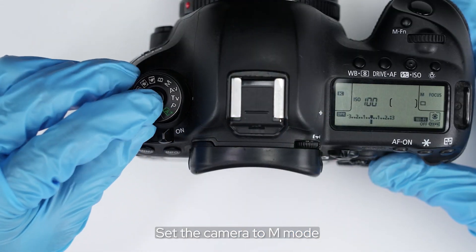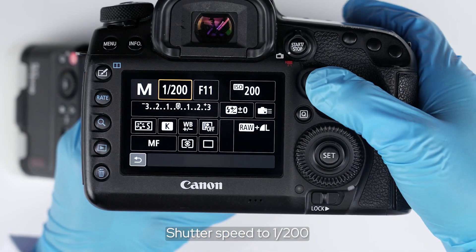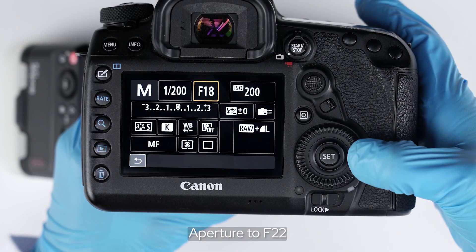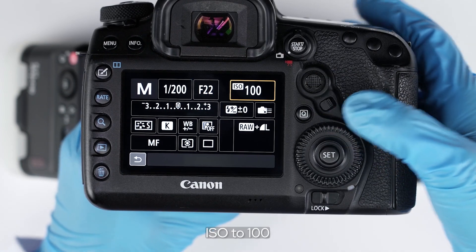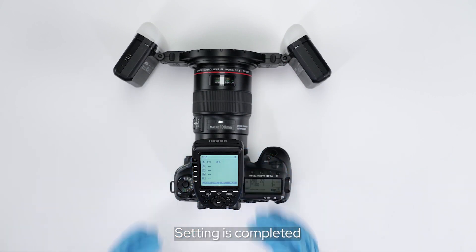Set the camera to M mode. Shutter speed to 1/200. Aperture to F22. ISO to 100. Test the flash. Setting is completed.